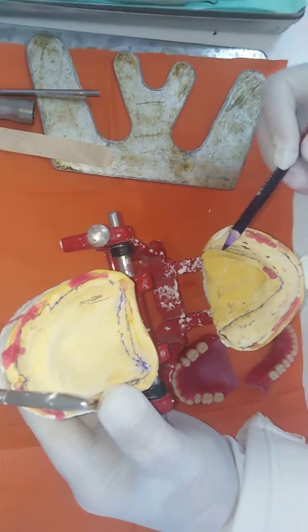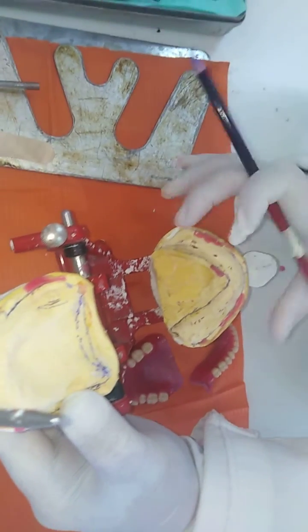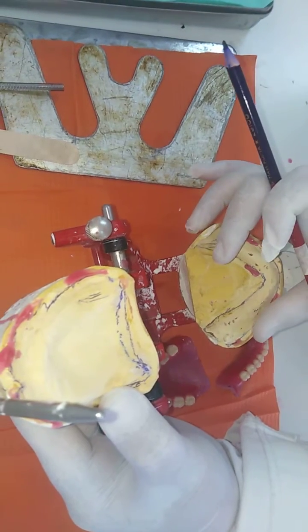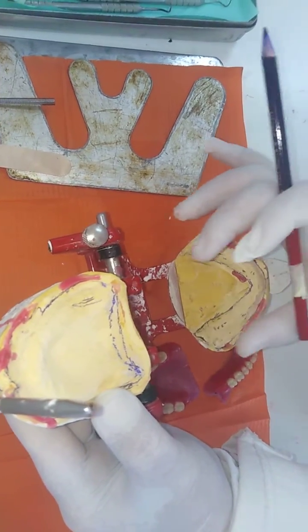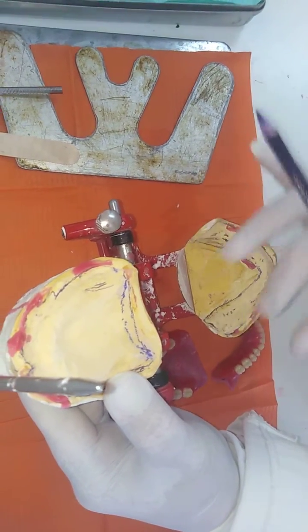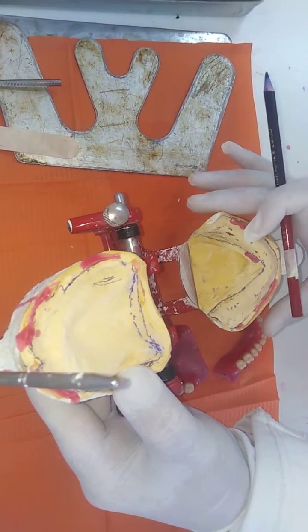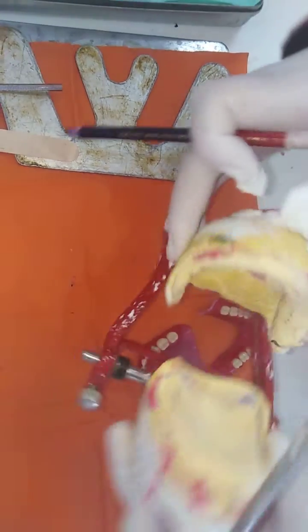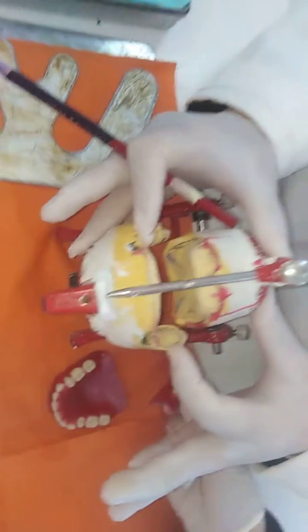Because once the patient has a lot of resorption, the bone now is in the wide area of the mandible, not the narrow area. We remember that the teeth were somewhere here, more lingual here. But once the resorption goes down, the body of the mandible is wider from the area where the teeth were present. So we're going closer to the wide area. That means there is a horizontal discrepancy between the small maxilla and the large mandible.